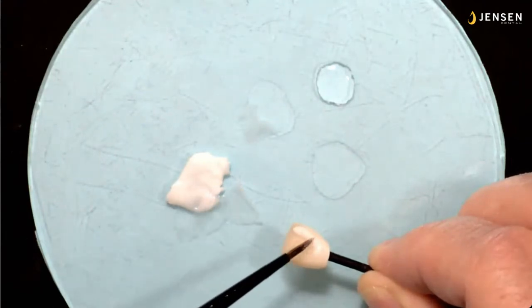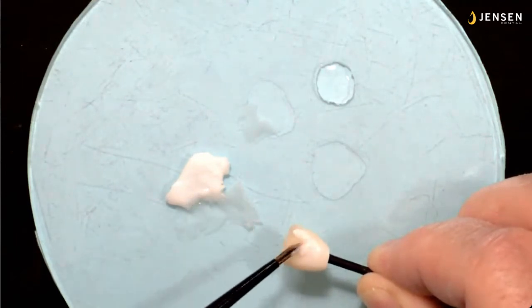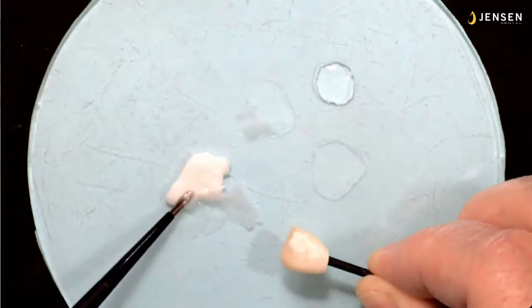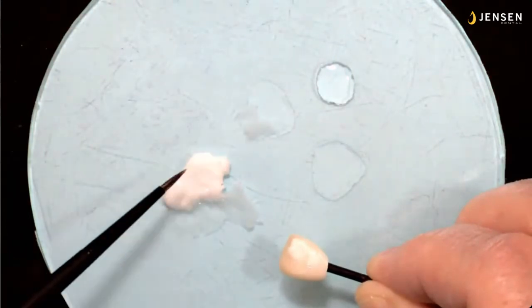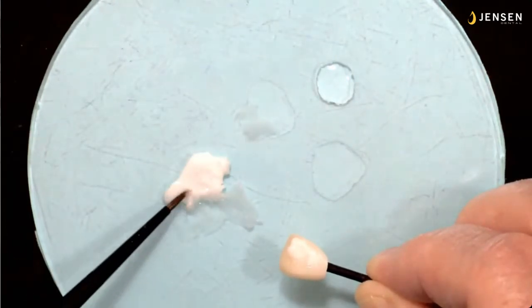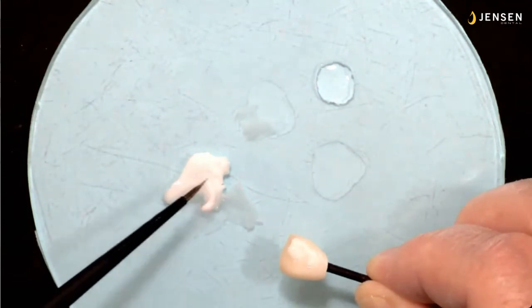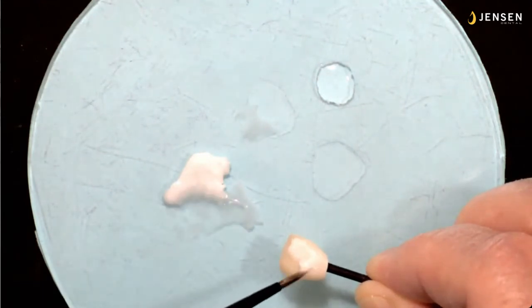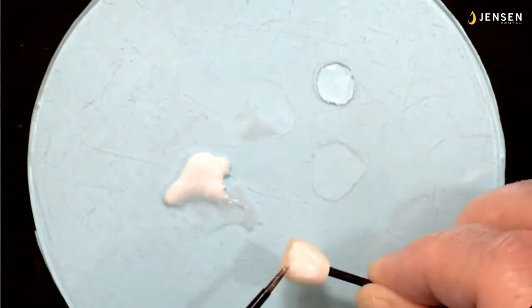Personally, if I get like 90-95% of the coverage and it's already the right dimension, I don't have to worry about getting it too thick or too thin. And while I'm talking about that, I want to mention that one of the biggest things that people do with structure in the beginning is they apply it too thick. Structure needs to be about 2 to 3/10 of a millimeter thick. You don't want it 6 and 7 and 8/10 of a millimeter thick, because then it defeats the purpose of the depth. You get all the depth you need in about the thickness of a business card or slightly more.